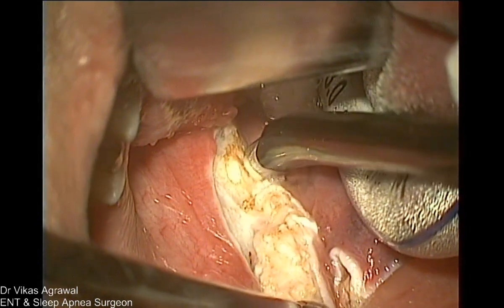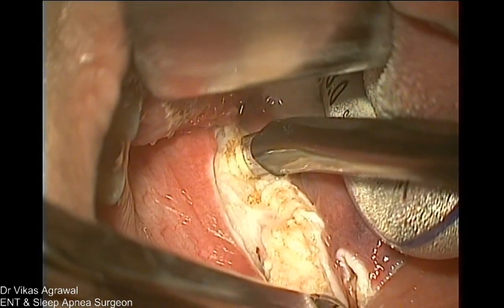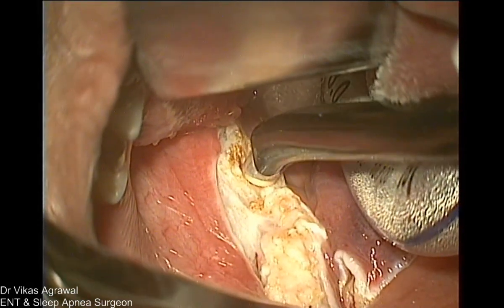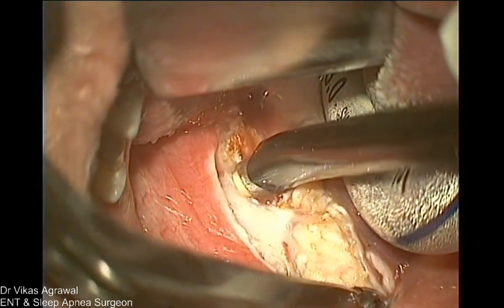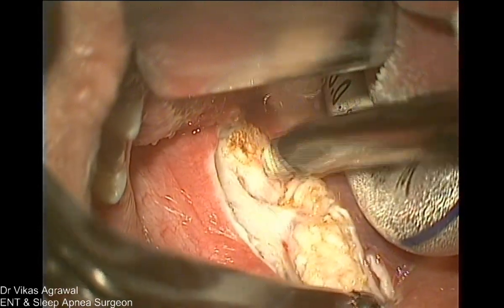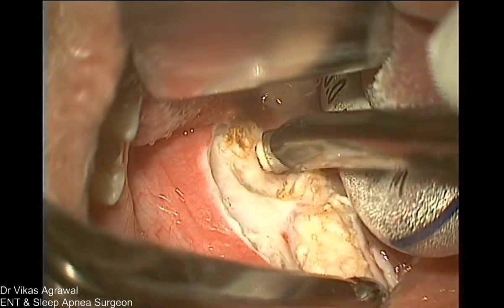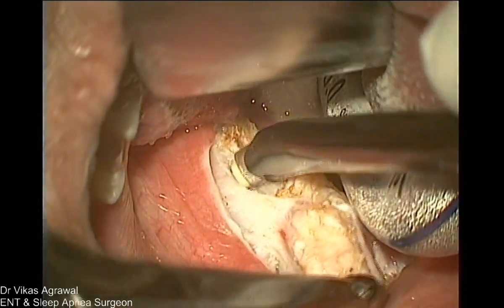Okay. So this is like taking a tie but without exposing the vessel. Now, can you see that? Oh, that was the lower pole of the tonsil and that was the tonsillar artery. By mistake it was exposed. This is what I did not want, but unfortunately it got exposed here.